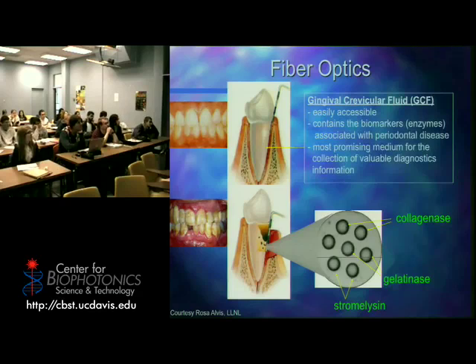What she wanted to do is, instead of having that be a metal tip, put the fiber optic bundle there with the 10,000 little fibers in that tiny little thing, so that when it's poked in there, she can put some special detectors here that will react if there are products there in your gums that are likely to be precursors to gum disease. So it's like an early warning system. She wanted to poke it in there and see if there's early signs of gum disease.